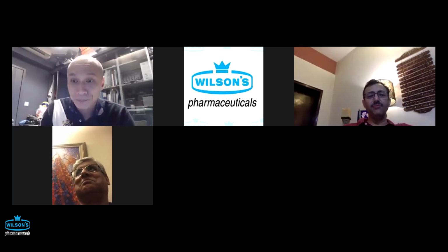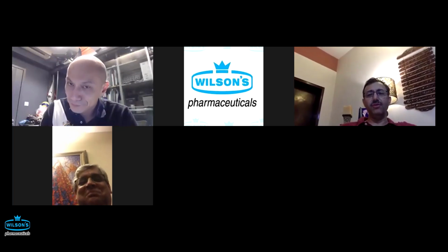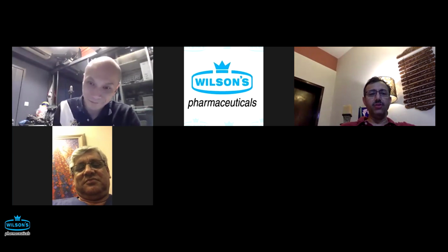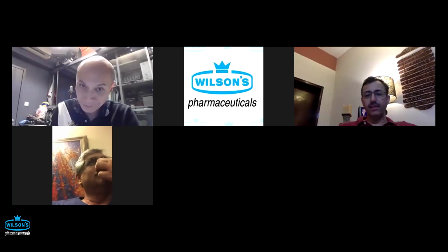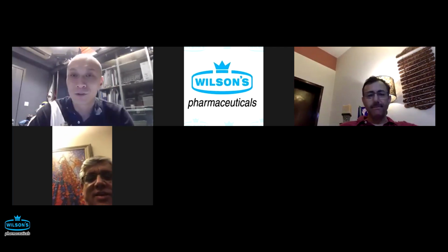Don't you think that's more of a historical definition? Because over the years, I know that stones up to 18 millimeters we are able to take out without any difficulty with large balloon sphincteroplasty. It's only the bigger stones that we really need to think about in different terms. I should like to take the views of Saad as well, but first, Anthony, please. Yeah, it's more of a historical definition for sure.